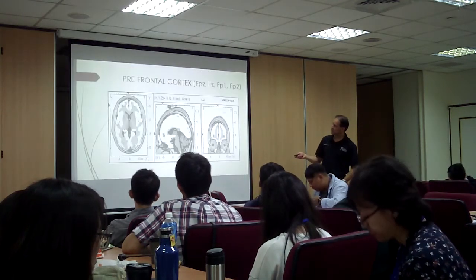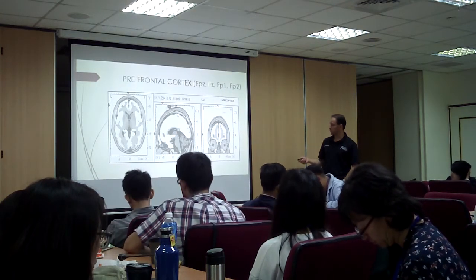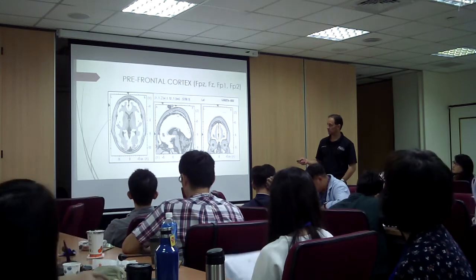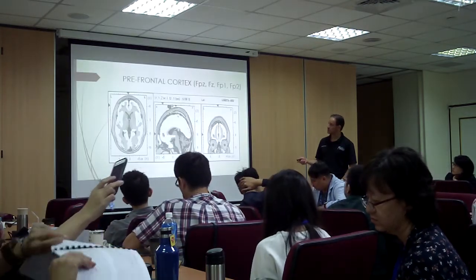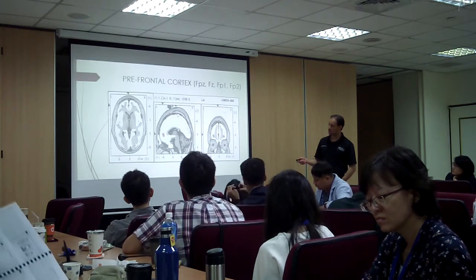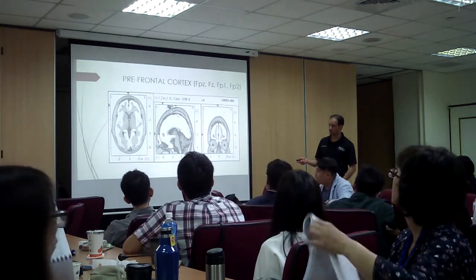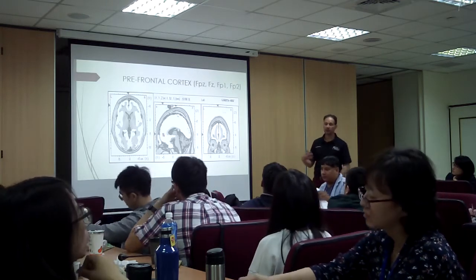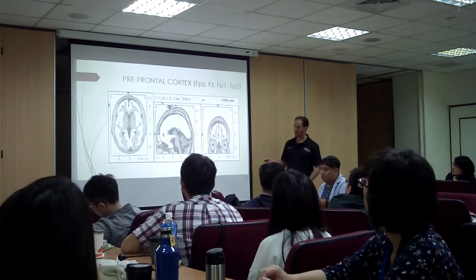Let's see what we have. So, okay, this is what it would look like with LORETA and sLORETA, which we're going to look at later. So this is the prefrontal cortex, and here's your activity. The red dots mean that's the problematic network. That's where the algorithm is finding the problematic area of the brain.